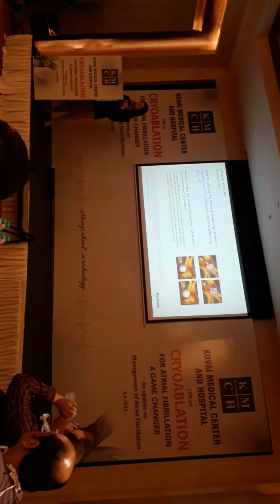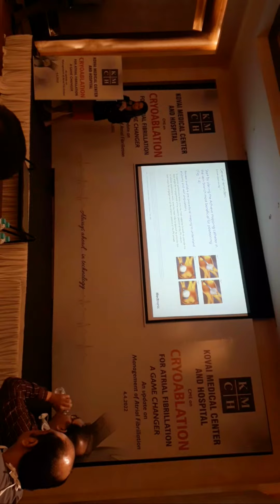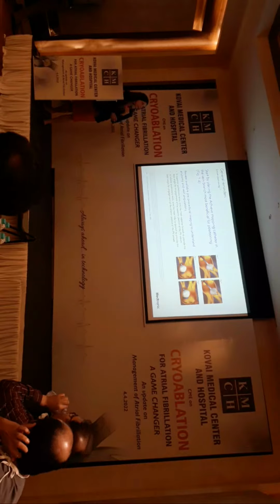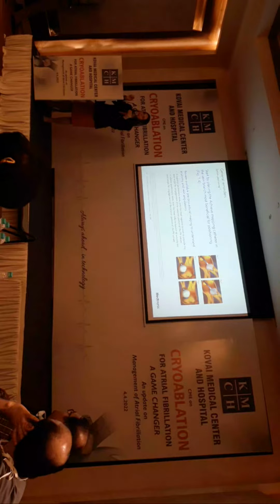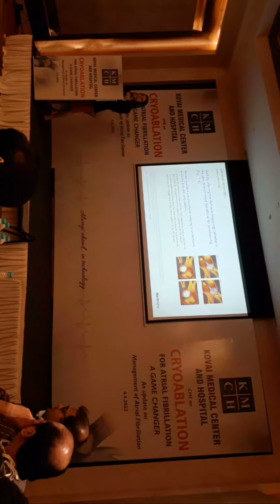You know, and here he showed you some live photos of the balloon, but it's true. We don't want to do any type of ablation, maybe this isn't clear, with the balloon in the vein. And the true fact is, by the size of this balloon, it does give not only vein isolation, but the tissue, that antral tissue surrounding it, which is super important for even patients who end up having persistent.